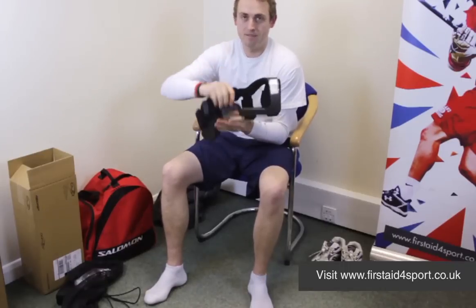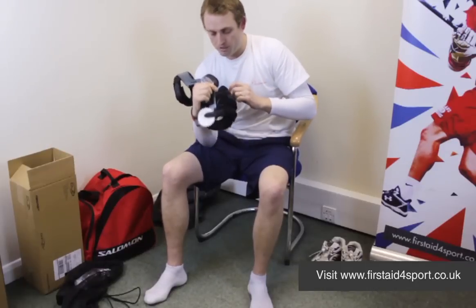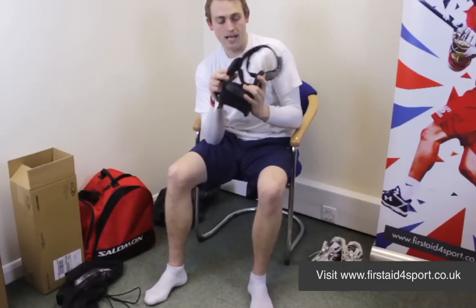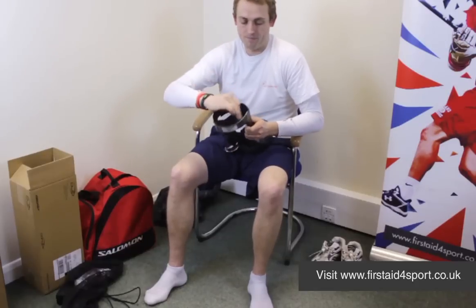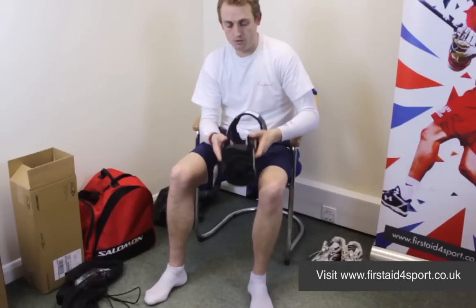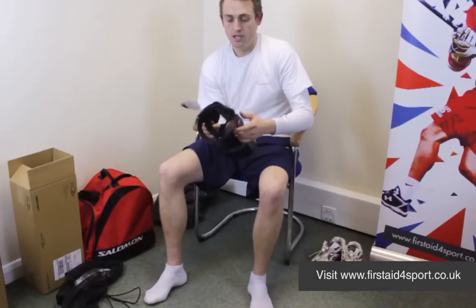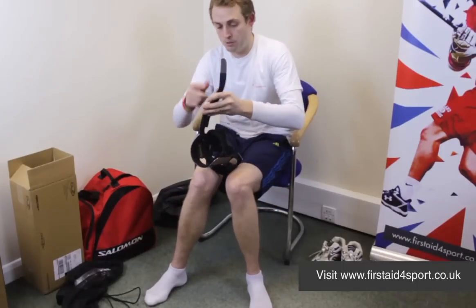So it looks nice. The full force hinge — we'll do another video to show the exact workings of the hinge, but it's all adjustable in here and the condyle pads come off. All of the pads on the Armour are replaceable. It works on DonJoy's four-point principle and all the straps are numbered. It's a really simple brace to put on, but it's really important that you put it on right.